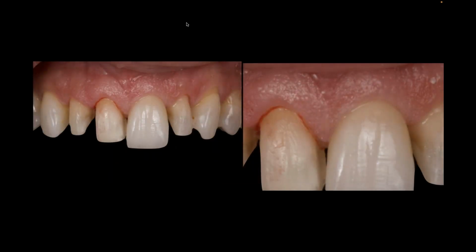And I want you to look at how nice the tissue looks and how healthy the tissue looks as we insert. And also look at the coloration. If you look at the natural cuspid that you see there, the number 6 or the 1-3, you'll notice that she has a density to her teeth, meaning that they're not super translucent. Maybe she bleached. She kind of has that whitey, milky look to the tooth, but you see the chroma, you see the value, and you see a little of that incisal translucency.